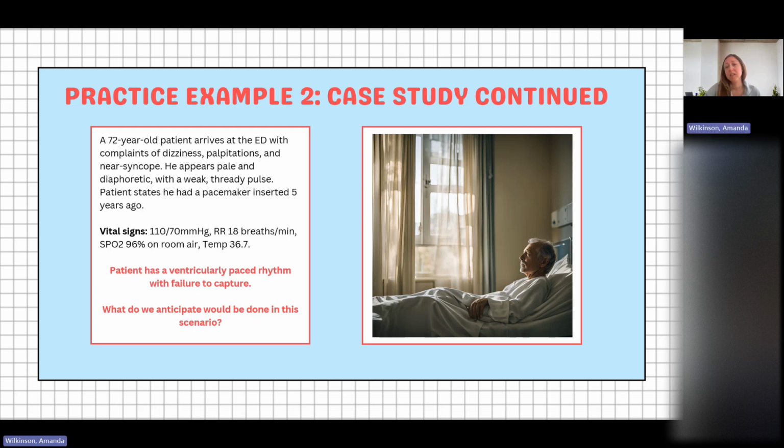Some things to consider: pacemaker battery or lead malfunction. It could be failing after 5 years, and lead fracture or displacement is possible in this time frame. What else? Inform MRP, pacer pads in the meantime. Great. That's great. And then all of our other typical stuff.